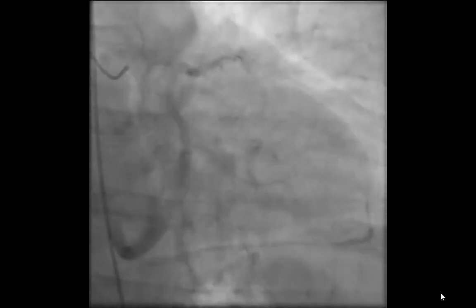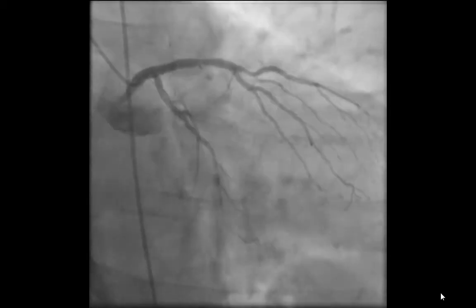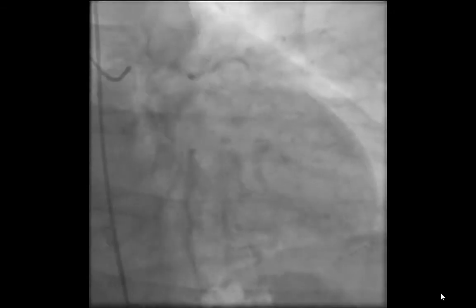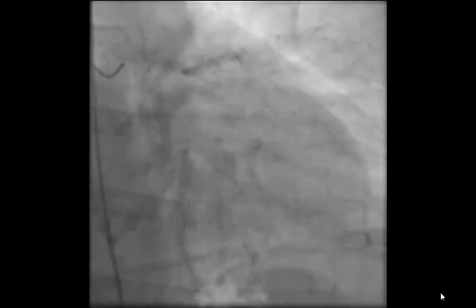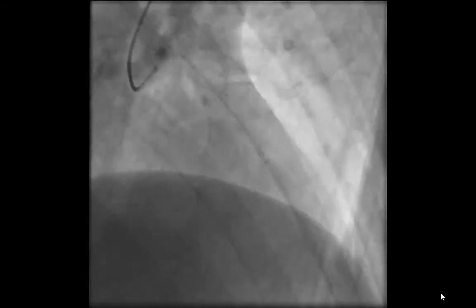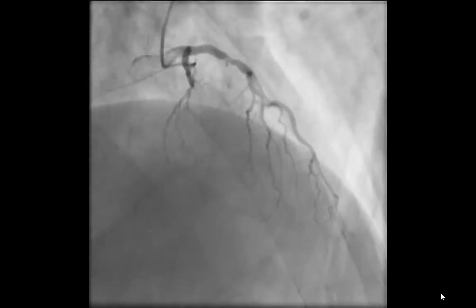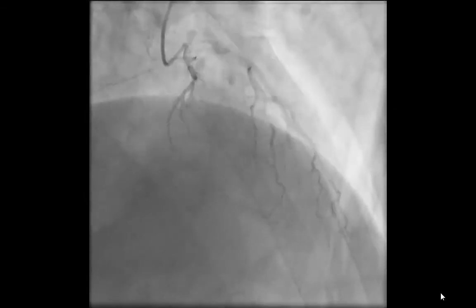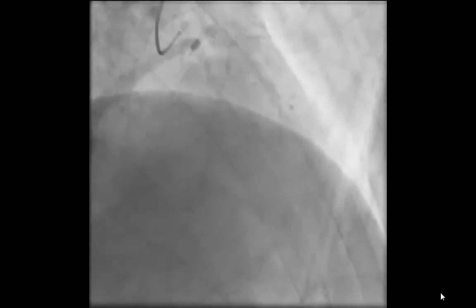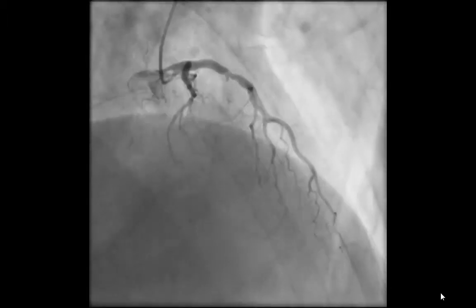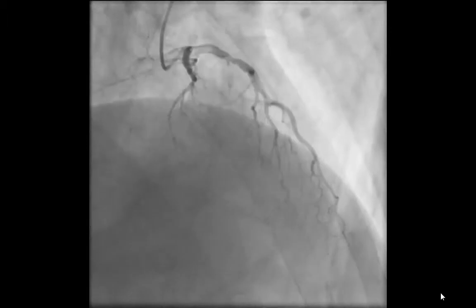As you can see here, this is an anterocaudal view of the occluded LAD, a large diagonal branch that takes off, and you can see a very short stump of the LAD there. This is in a cranial projection, and you can see clearly that the LAD is occluded in the proximal segment with significant calcification with not a lot of cap or stump to allow purchase of the wire.